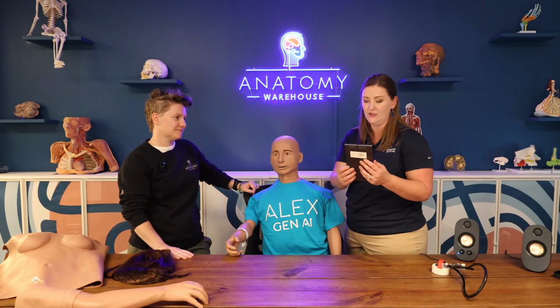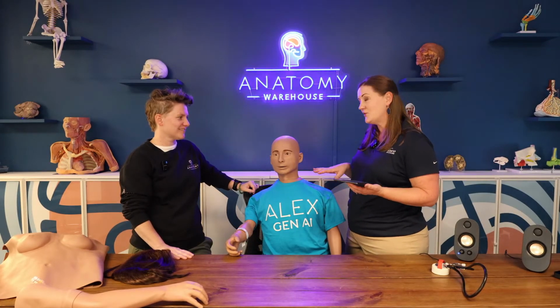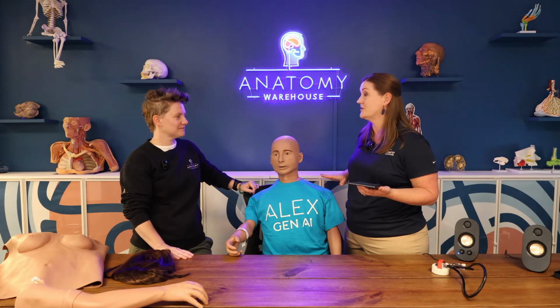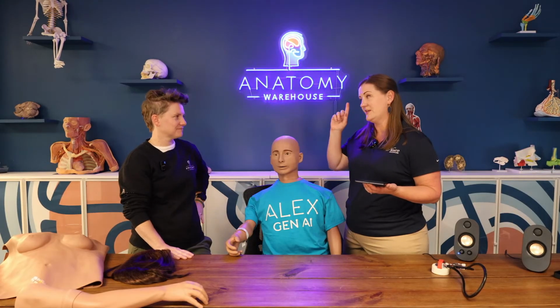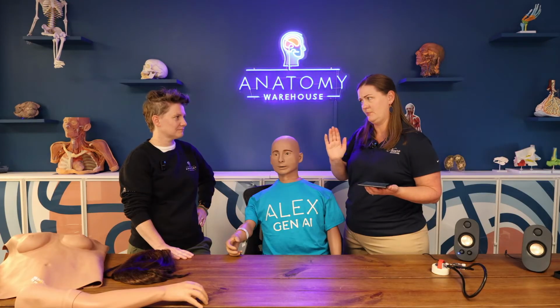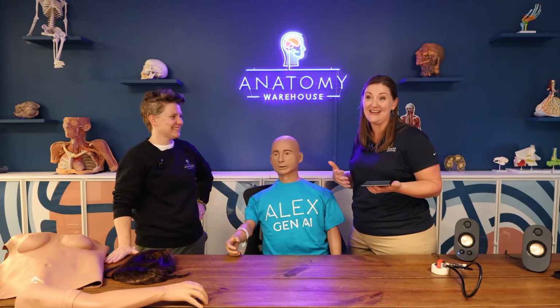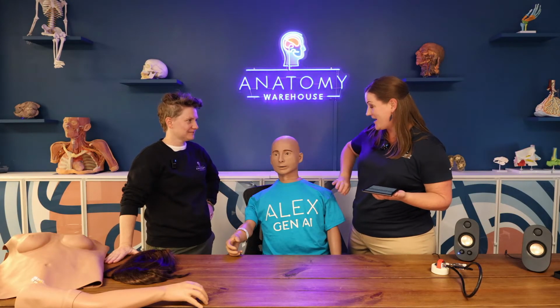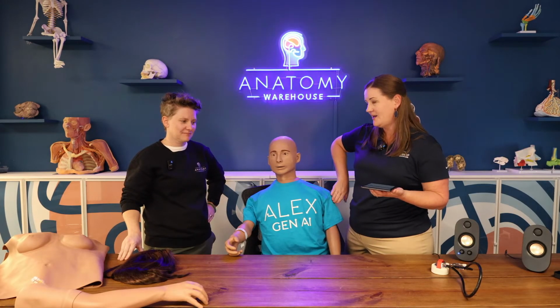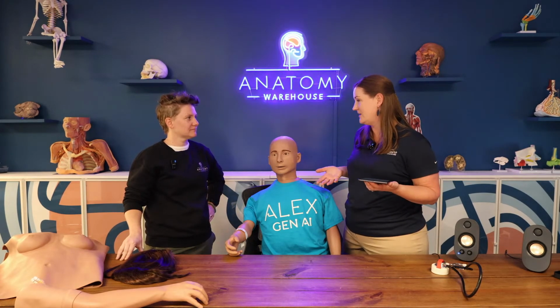Absolutely. So should we have a chat with Vivian and see how she's doing? Let's do it. The mannequin is set up with a couple of different noises. When we touch the mannequin's shoulder, there's a sensor in the shoulder, and what we will hear is a high tone, a beep beep, and then a low tone, a beep beep. That means the mannequin is waiting. Let's hear the high tone and the low tone. You can hear the differences in the tones. That's a key factor when interfacing with the mannequin.